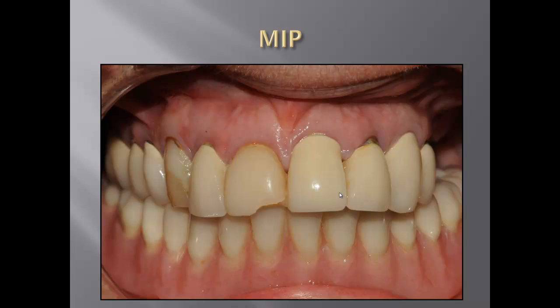But the patient complains that she has to find her bite. It means the bite is not stable. And when she bites, she has a tendency to move her lower jaw towards the front. Besides her other oral habits, I want to make sure that when I deliver my restorative crowns, she will not repeat the same problem with the permanent restorations.